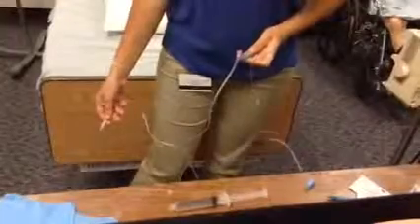So we're going to make sure everything is open, and just let it run. Just make sure it is working. And we're going to close it back up, and just hang it up for a little bit.